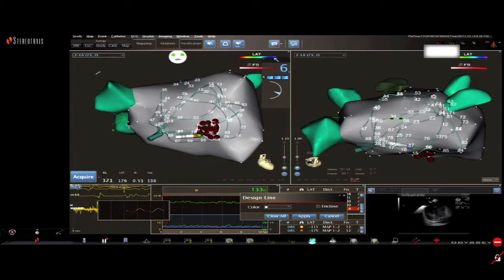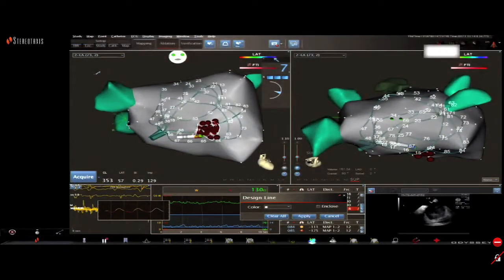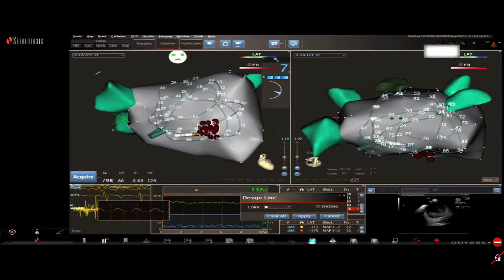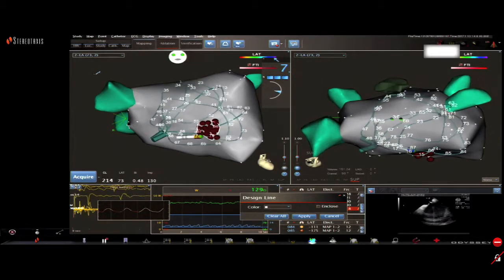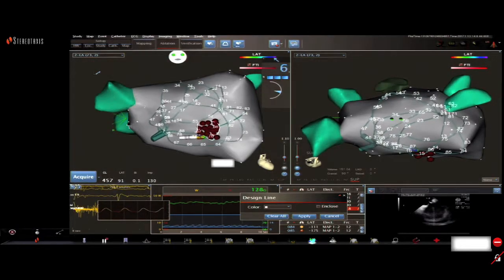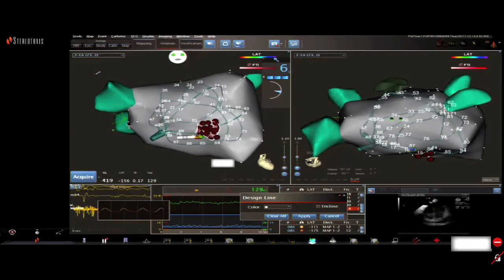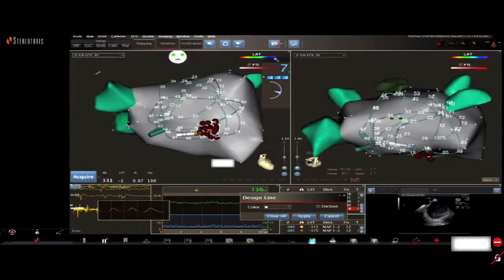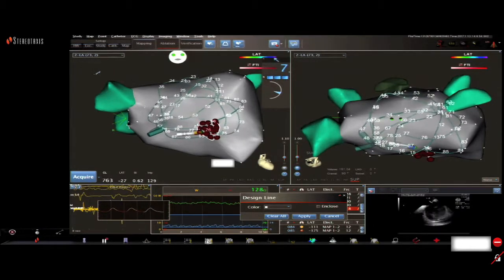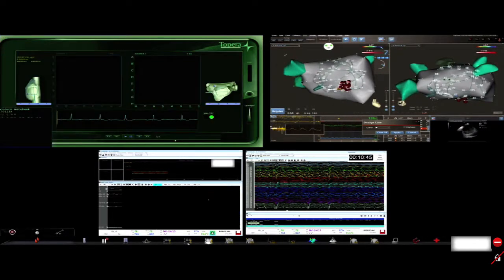So while we're waiting for this map, we saw 3 approaches this morning for persistent AFib. We saw the non-contact mapping from Prague. We're seeing now rotor mapping from Chicago. We saw fibrosis ablation. Can we go over the panel and you can tell us briefly what you do in your labs for persistent AFib patients? Maybe a minute or so or less per person. Andrea?